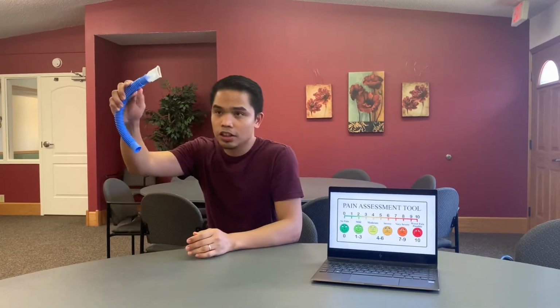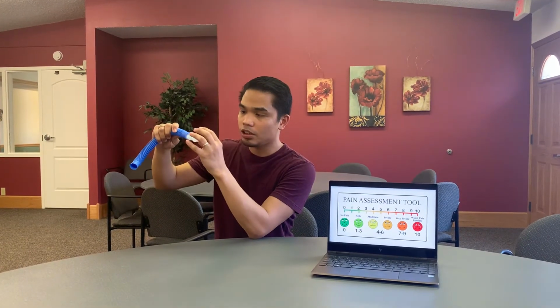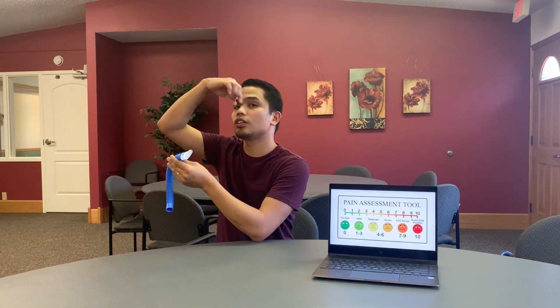They should be in a relaxed position with their legs and hands on the sides, and their chin should be straightened up, not like this. And this is the mouthpiece. When they put this inside their mouth, make sure that they seal it tightly with their lips, with their tongue underneath. We also always put the clip on so that there will be no leak through their nose.